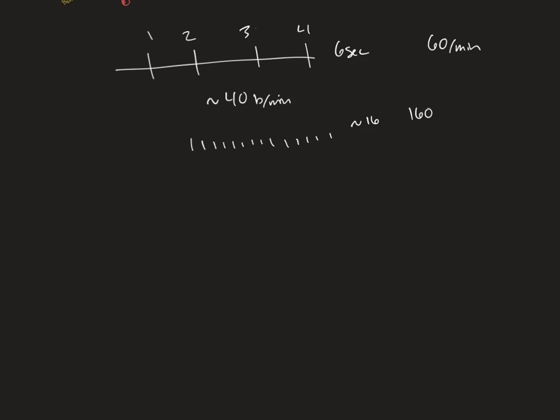And this is kind of where I wish I was on Notability so I could draw lines, but essentially on a 12 lead, you have the little boxes, right? And the little boxes are comprised of smaller boxes. Each of these medium boxes is representative. Once you find a QRS that lands at least somewhere near, or if you just march it out with calipers or a pen or something, then you can kind of determine this, right?